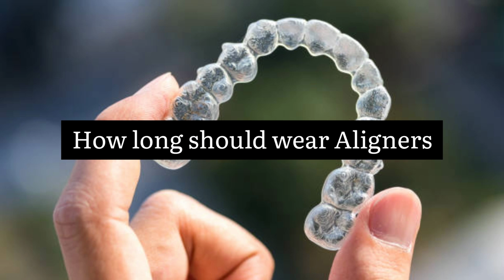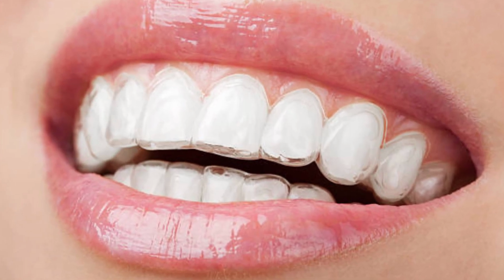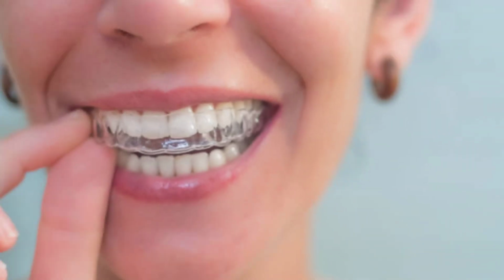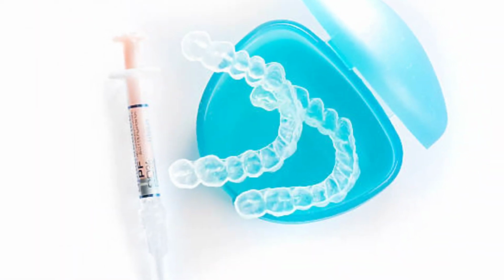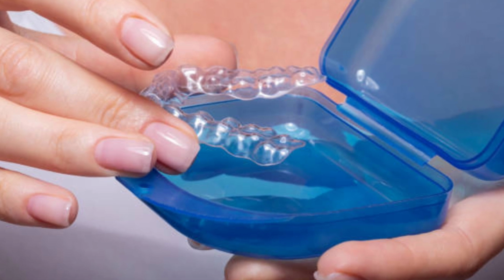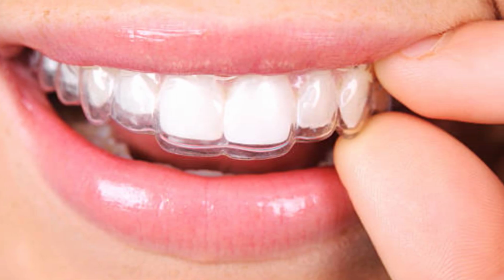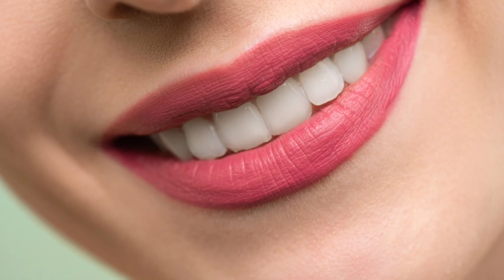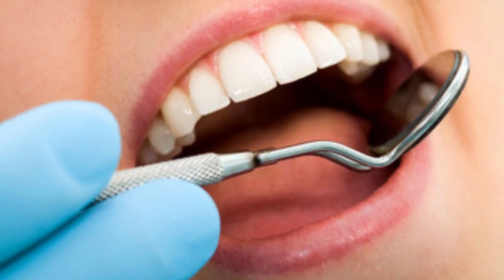How long should we wear aligners? For effective teeth straightening, you must wear them for about 20 to 22 hours per day and should change the aligner tray every 1 to 3 weeks. Multiple sets of aligners are used because a single aligner is only capable of moving teeth slightly, about 1 millimeter or less. Each set of aligners will slowly move the teeth into the correct position. Treatment can take anywhere between 3 and 24 months.